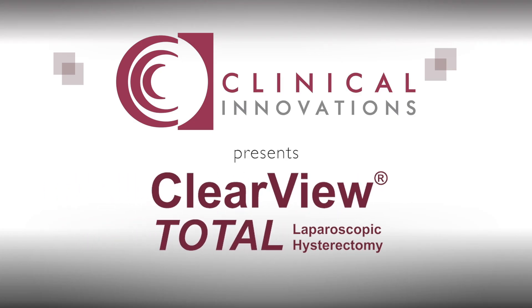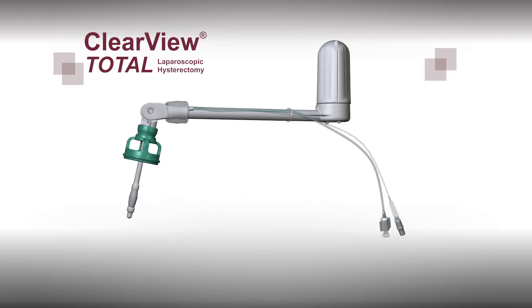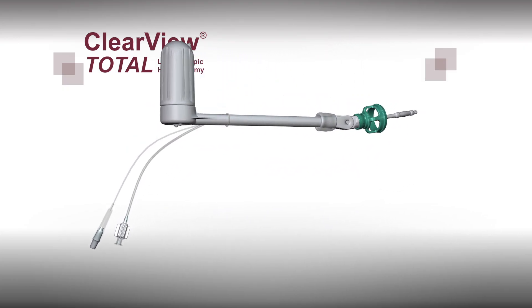Clinical Innovations Clearview Total is a uterine manipulator with a colpotomy cup and an occluder balloon designed specifically for laparoscopic procedures.